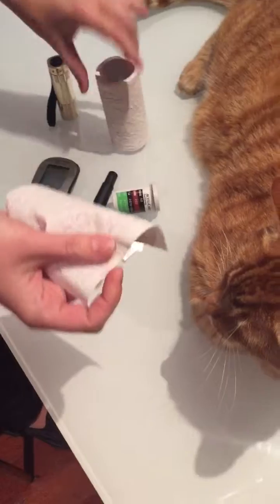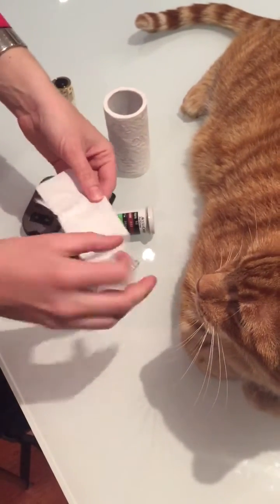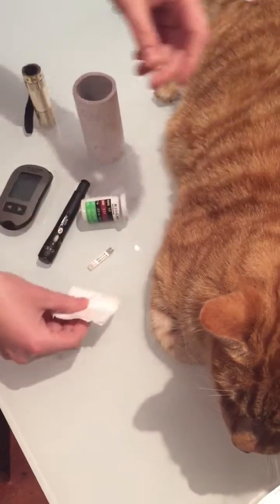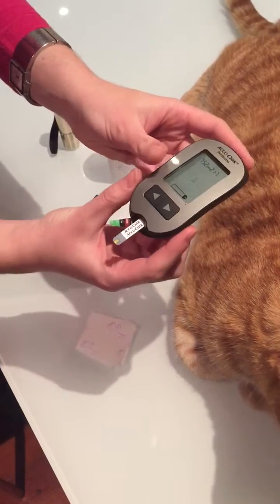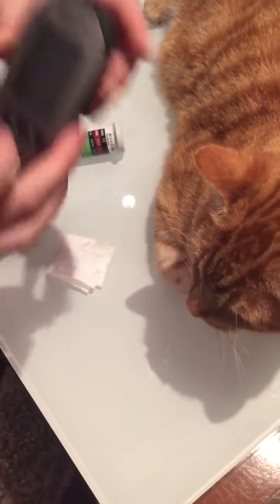So first of all we're going to take a square of toilet paper and fold it — this will act as a cushion. Actually, first of all we're going to put the testing strip in so we're all prepared and ready. So this is now ready for a blood sample.